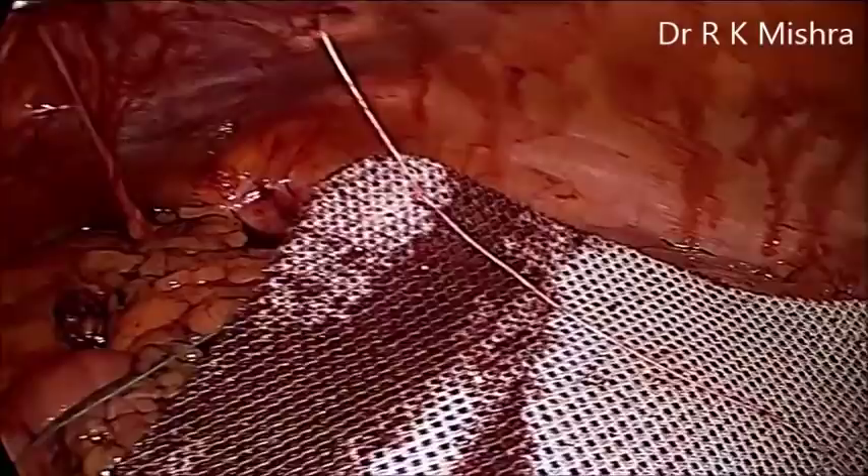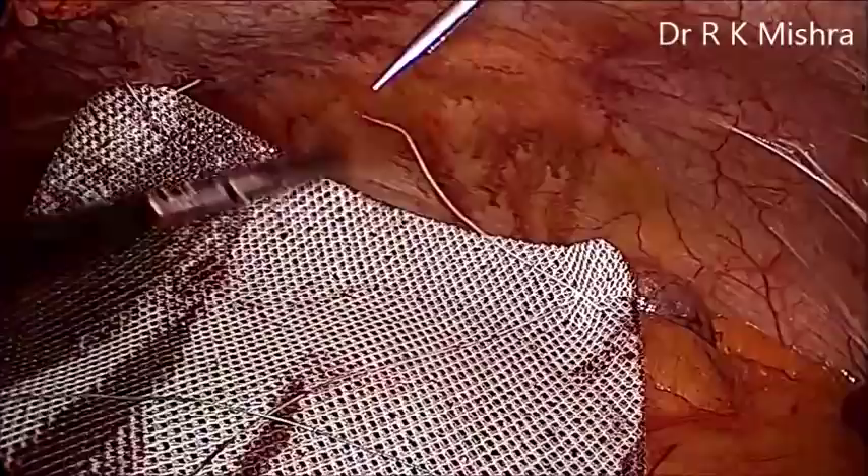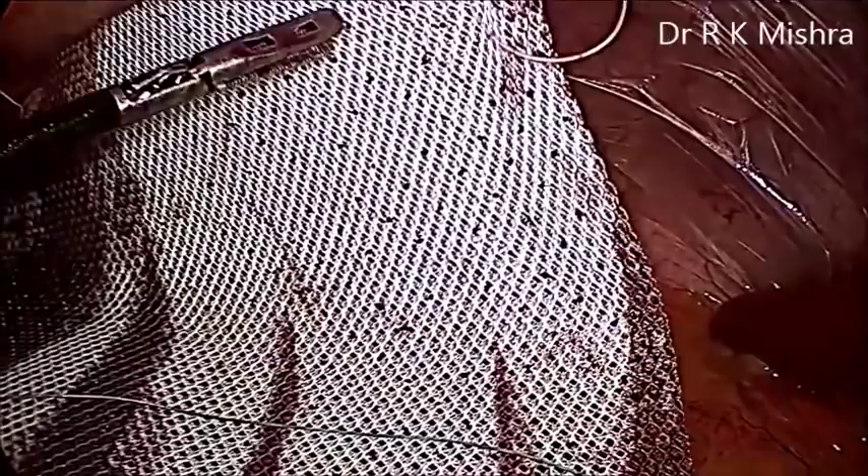It has two colors. The white color should be towards the abdominal wall and the blue color should be towards the bowel. The white color is a polypropylene component, and the blue is the polyurethane component which is supposed to be non-adherent and will decrease the chances of adhesion. Although no large trial on humans has confirmed how much these costly meshes help.